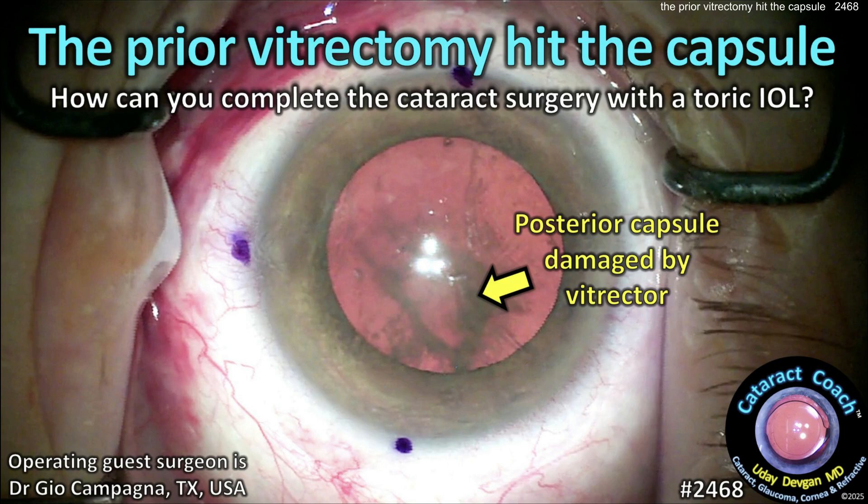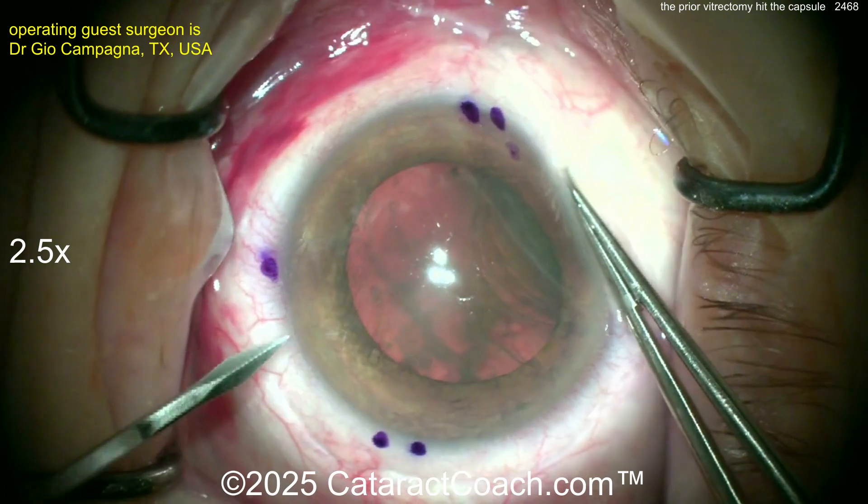Cataractcoach.com. The prior vitrectomy hit the capsule. Now, how do you complete the cataract surgery with a toric IOL? Tough case here.